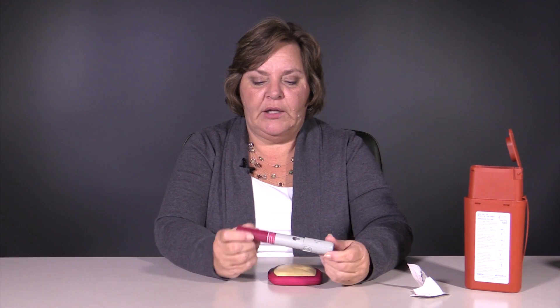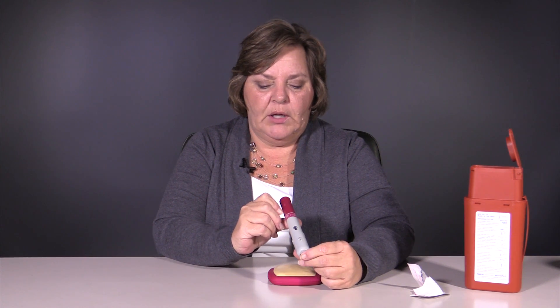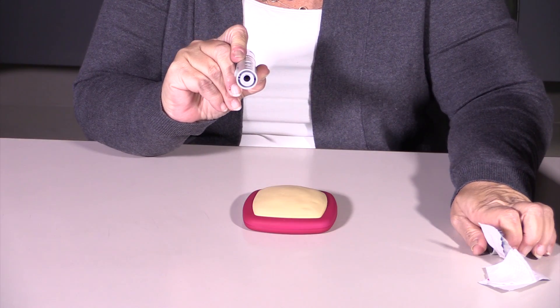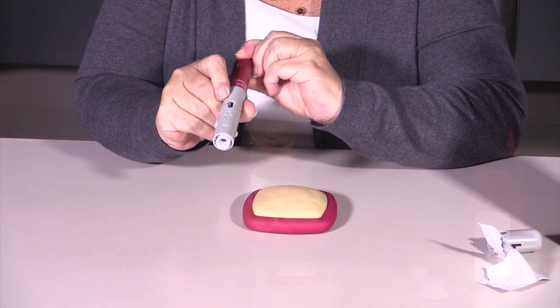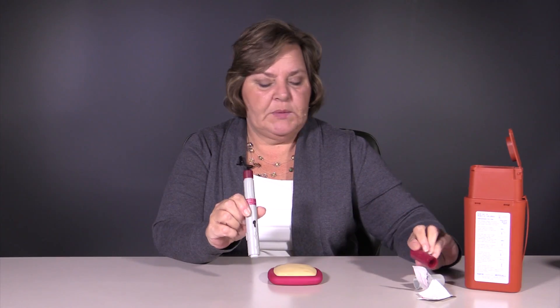The next thing we're going to do is ready our syringe. The company has made it very easy by showing you a number 1 and a number 2 on the syringe. We remove cap 1, and that exposes the area where the medication will be dispensed. Cap 2 exposes the trigger.